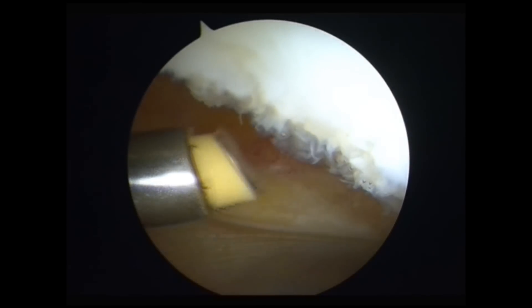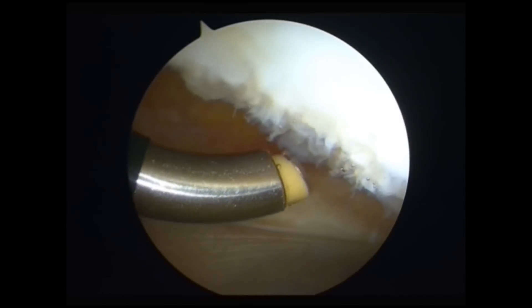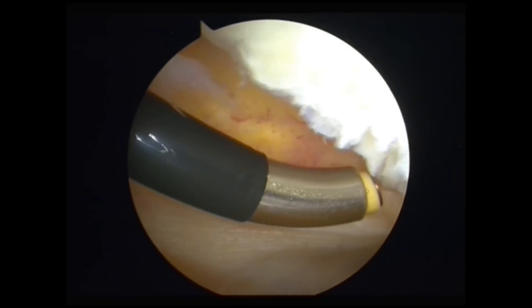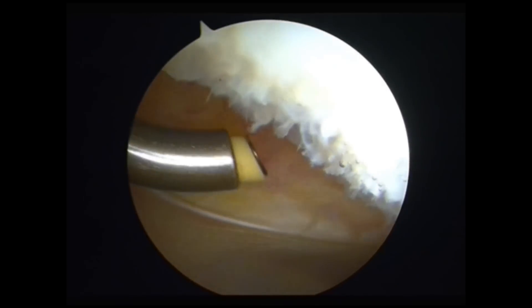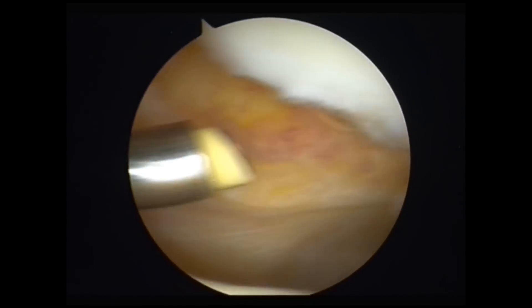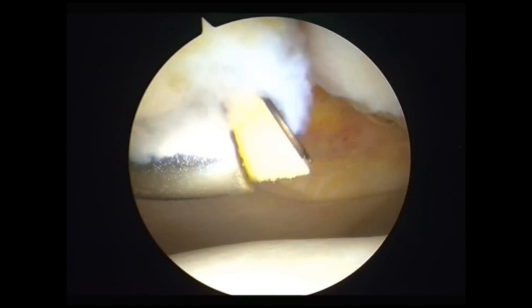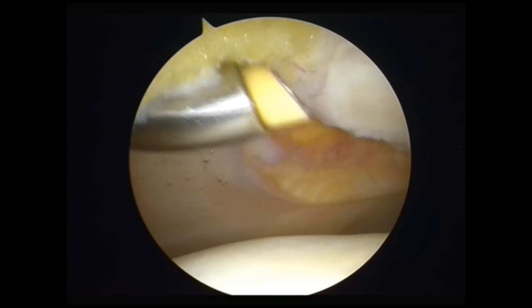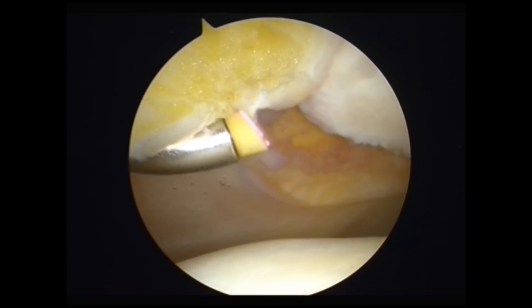Once we've done the chondral surface and made that smooth so that the patient no longer feels the crepitus going up and down stairs, we'll use the same wand to vaporize and seal the raw surface where we've removed that fibrous bit of Hoffa's fat pad that's caused impingement in the joint.